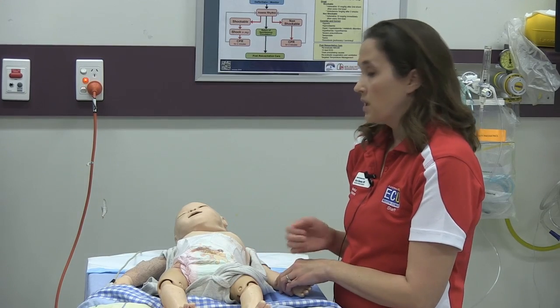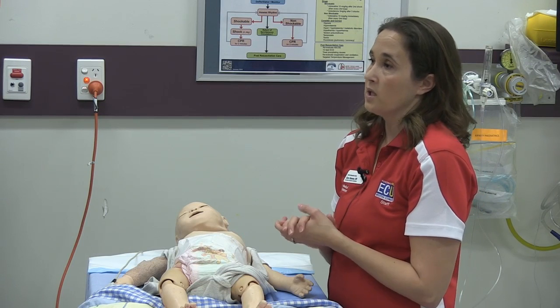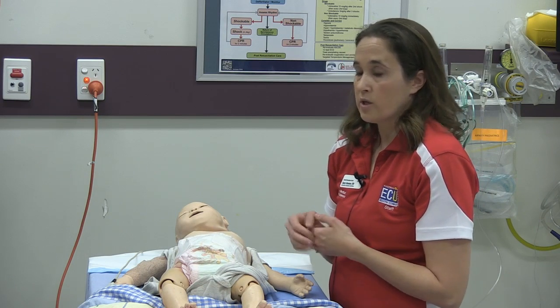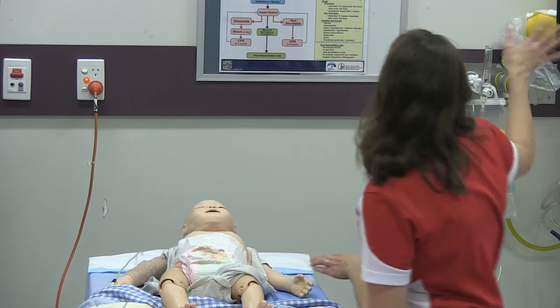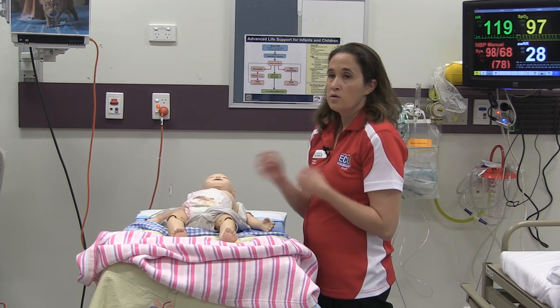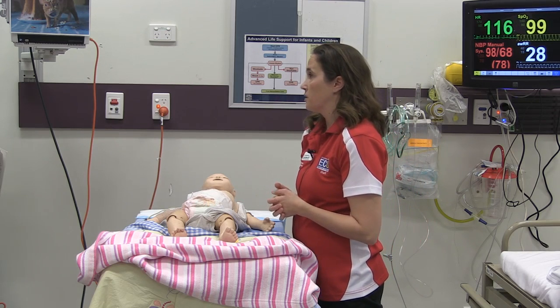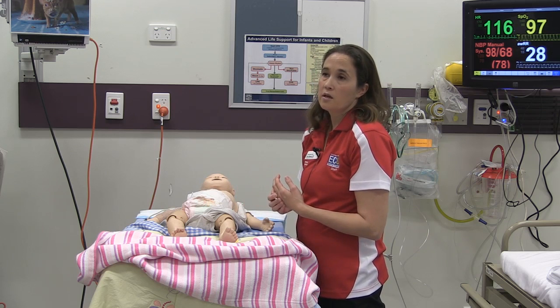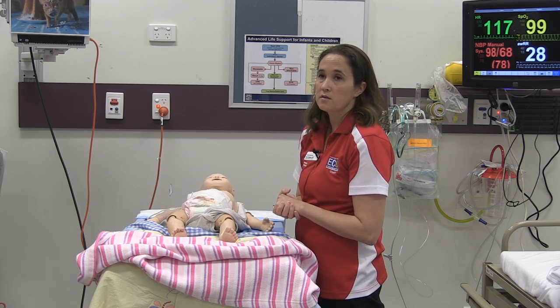Because, for instance, you can needle the chest in this Manikin. So if that's part of your scenario, you want to give them the opportunity to do that as well. Especially if they've never done simulation before, you want to have them learn how to hook up the monitor and see it on the monitor, and just stop for a few minutes so that they get that chance to really do the skill that you're going to be asking them to do, because that'll really pay off in the debriefing. They won't focus so much on the technology, but more on the methodology, those teamwork skills that you want to focus on, the crisis resource management skills that you want to focus on.